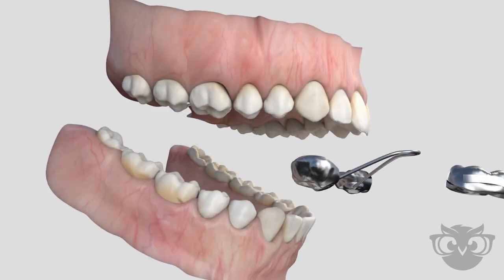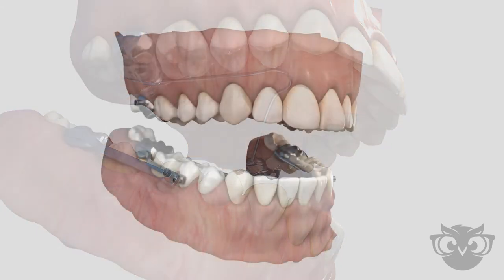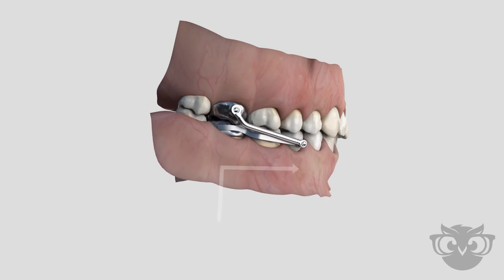This Herbst appliance is attached to two or more teeth on both the upper and lower arches. The top and bottom portion of the appliance are connected through guidance tubes on either side of the teeth. These tubes guide the lower teeth forward when the patient bites.